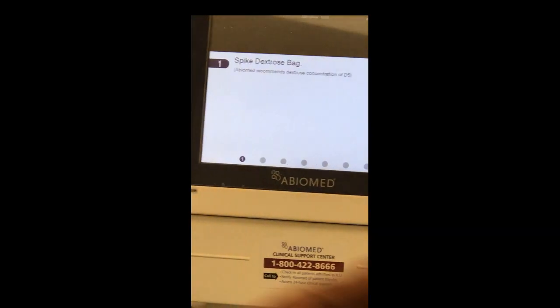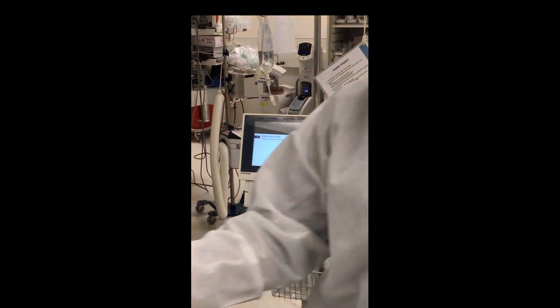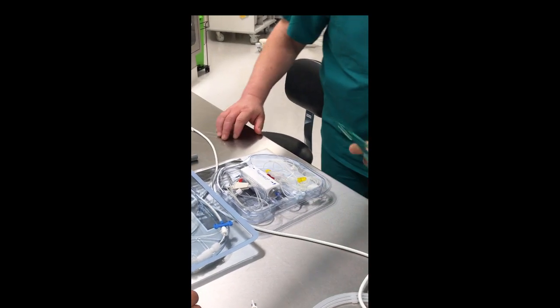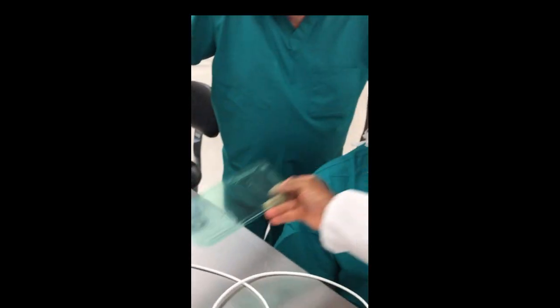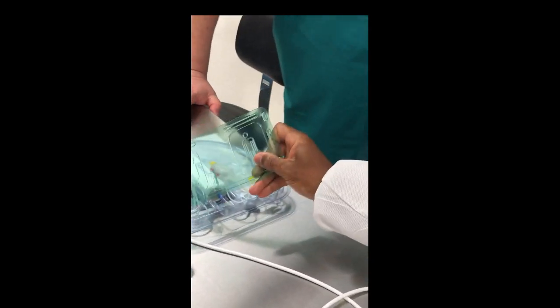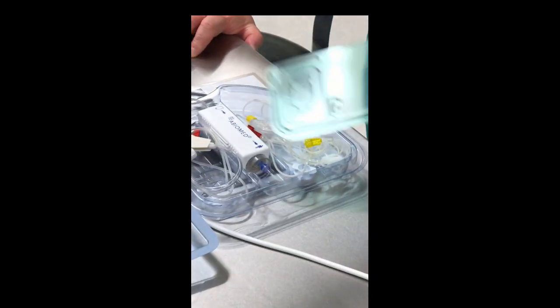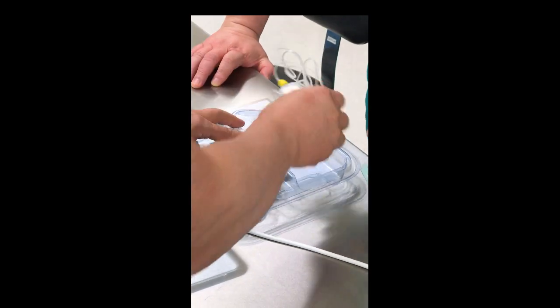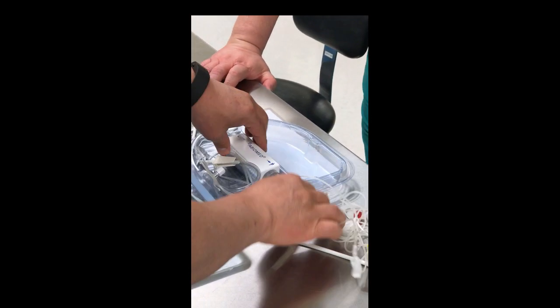Notice this portion goes to the patient — see the little man icon? This portion goes off the field. So these two things should stay in the tray, and this part should come out. Go ahead and take this portion out of the tray and leave it on your sterile field.